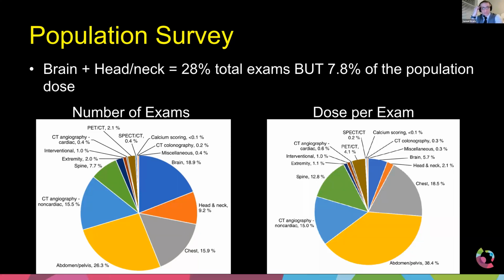The brain, our glands, and our eye lenses are probably the most radiosensitive. But besides that, it's just muscle and a little bit of fat, and there's not a lot going on for us. But most of the radiosensitive anatomy is down here, especially in the chest and the thorax, but definitely in the chest, abdomen, pelvis area.